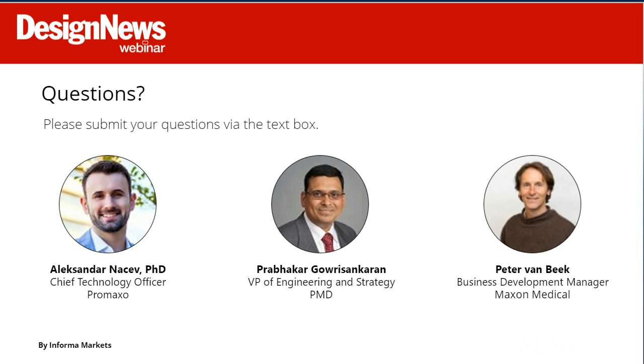One of them is vision. You can use cameras and depth sensors, or you can use laser guidance and laser depth, for example. And that helps you do quick bulk motion. But then, of course, for medical robotics, you care about what's happening inside the body. The outside of the body, you can align and register, but then what's going on inside? That's where the MR comes in, and that's where the robotic feedback comes in.